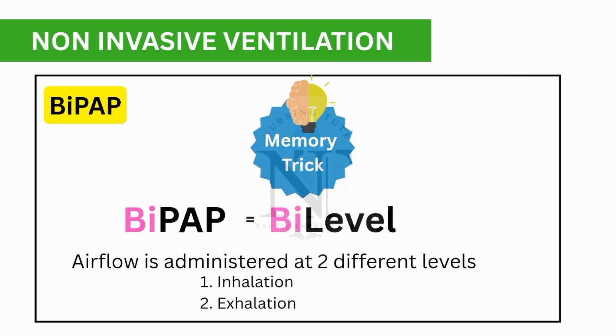And the memory trick is BiPAP. The name itself has bi, so think of bilevel. Airflow is administered at two different levels. Here bi means two. Okay. One level is inhalation and another level is exhalation.